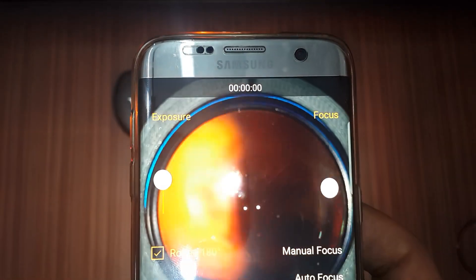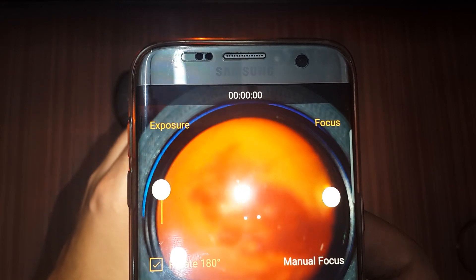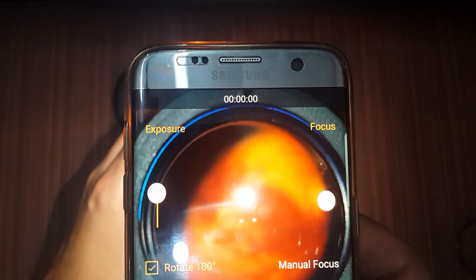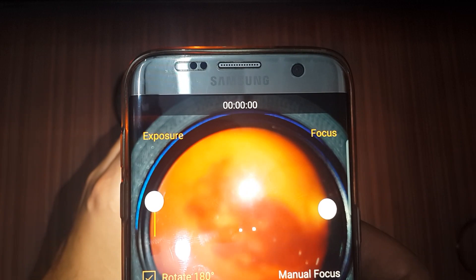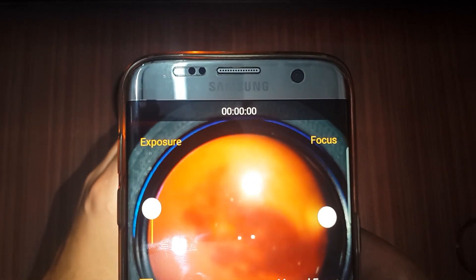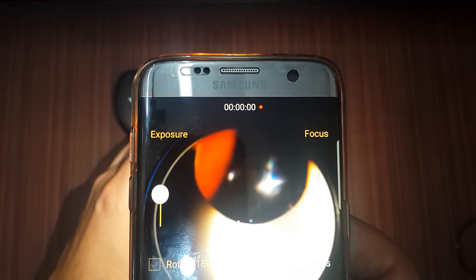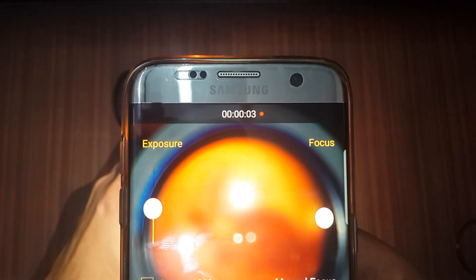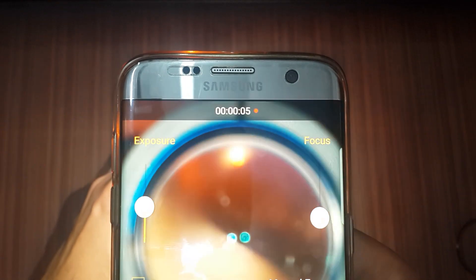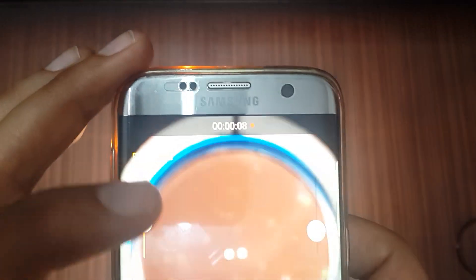I will use the sensor and the rotation option. After displaying it, you will see it is rotated — here you can see the disc is on the right. I will start capturing using the autofocus.